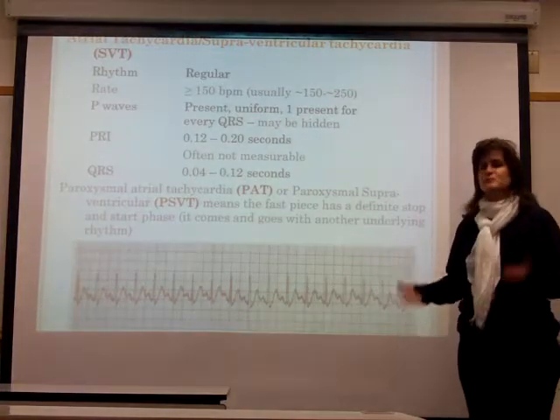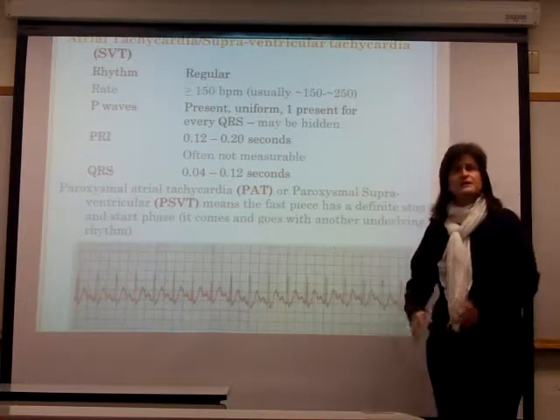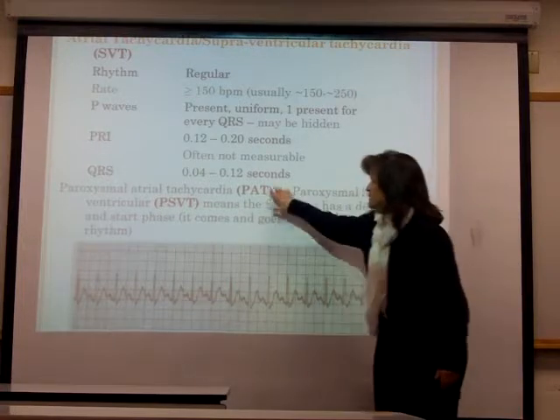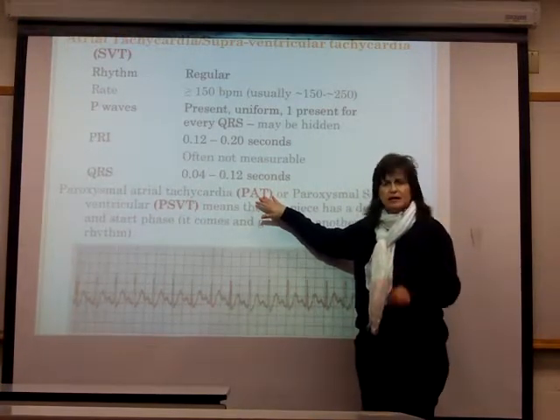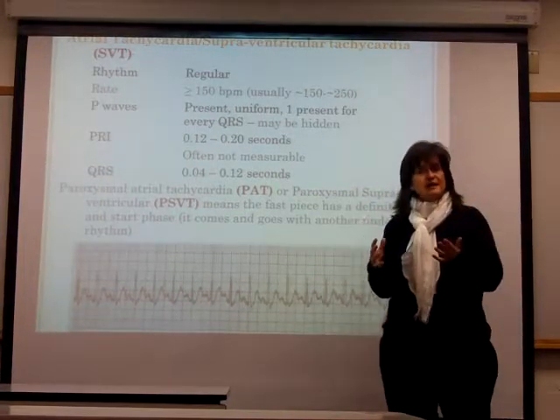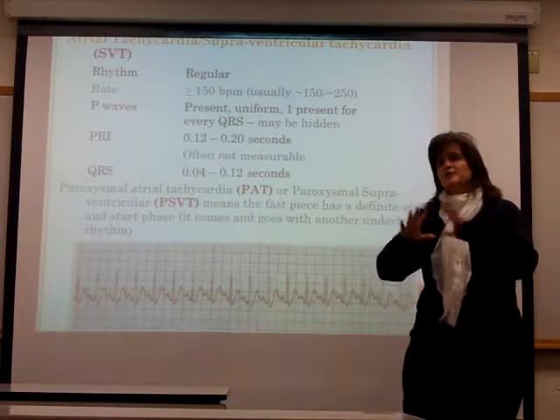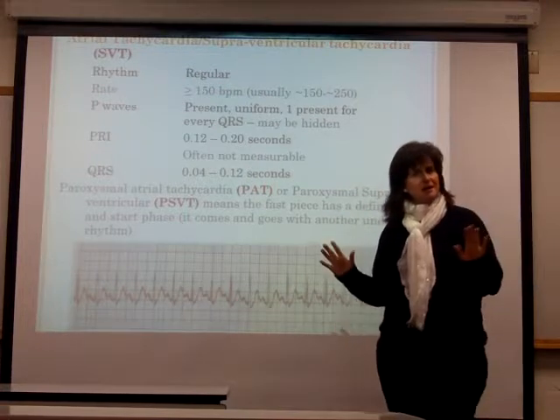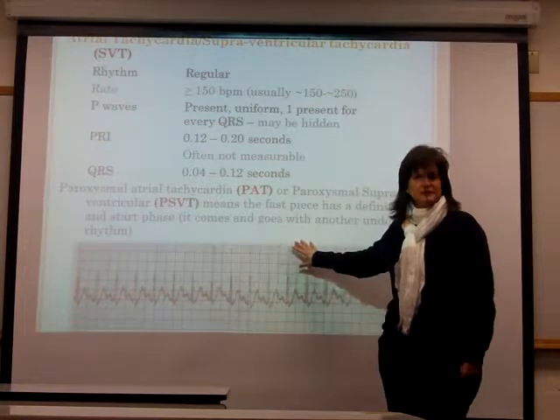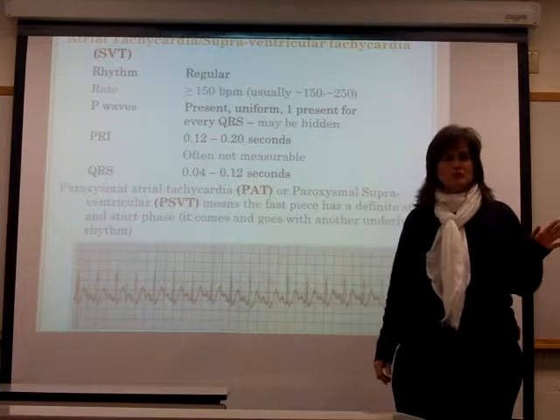But SVT, or supraventricular tachycardia, that's probably the most common term you'll hear in this region, probably in this country. You go out to more of the European type of scenarios, you're probably likely to see atrial tachycardia used. But again, it's a synonymous term. What's occurring here is that the rate is well above 150. So when we talked about sinus tachycardia and the treatment modality for that being a little more on the laid back side, because it doesn't necessarily mean the heart is stressed, all bets are off with SVT. With SVT, your heart rate is well above 150, usually closer to 200s.